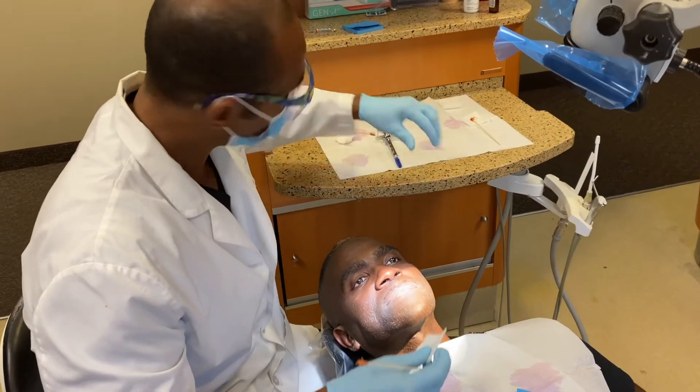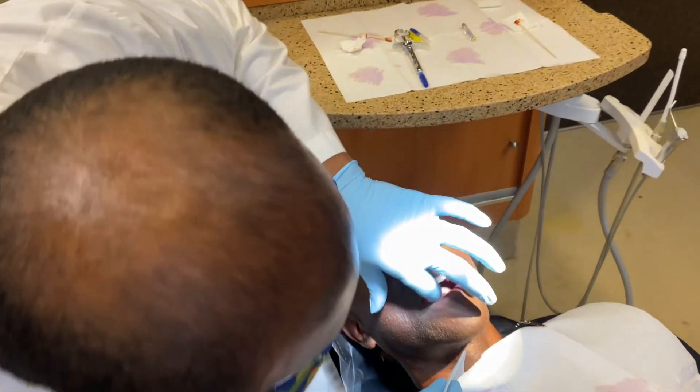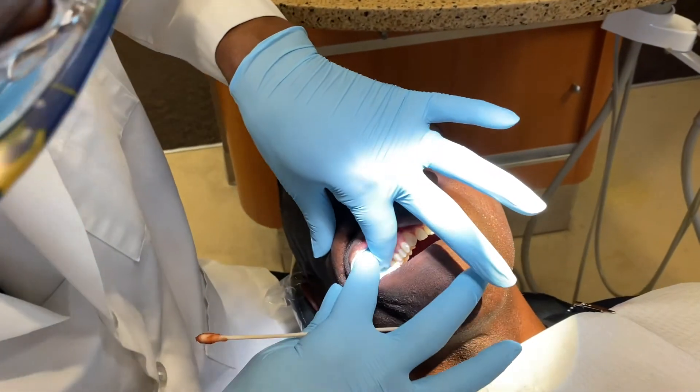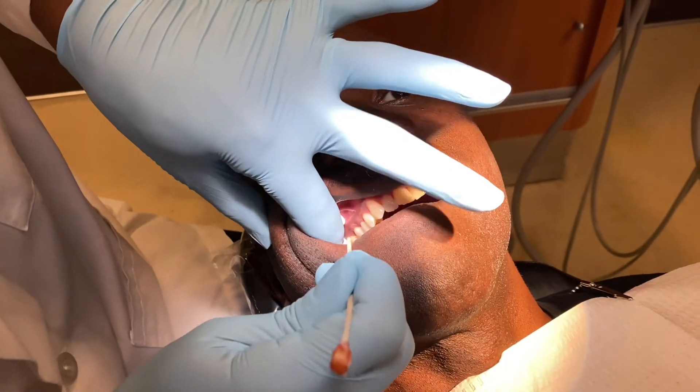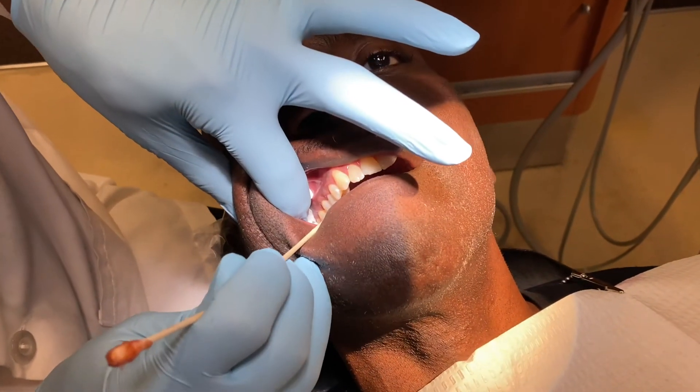I will start by placing a two-by-two gauze in the soft tissue area. For the PSA, our landmark is the second molar.